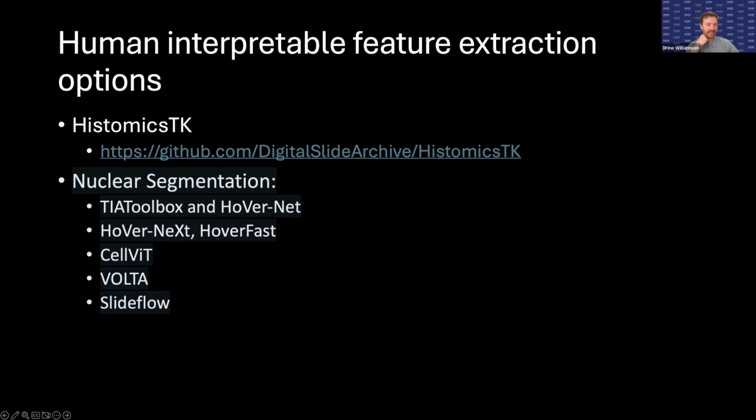Yeah, wonderful question. An important question too. To be honest, I'm not aware of anything that will do something like that on a pan-cancer level. I think, as of today, we're kind of stuck in a realm where we need to find some dataset, maybe publicly available, and train our own segmentation models for these things for a particular tumor type, or maybe non-tumor type. But going forward, I think there are other methods, and I'll talk about one later, that have maybe decent performance, whatever that means, doing this kind of segmentation in a zero-shot method.